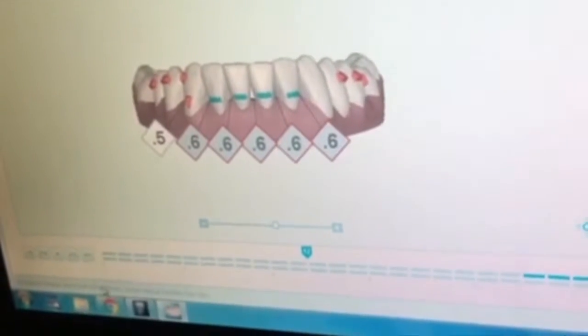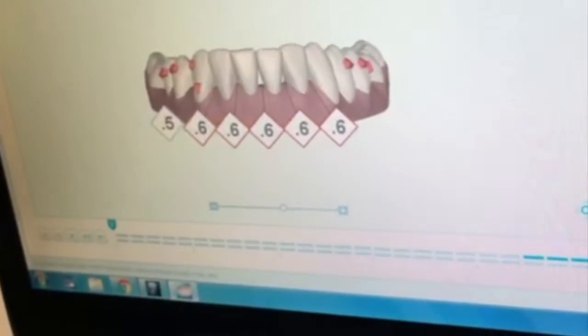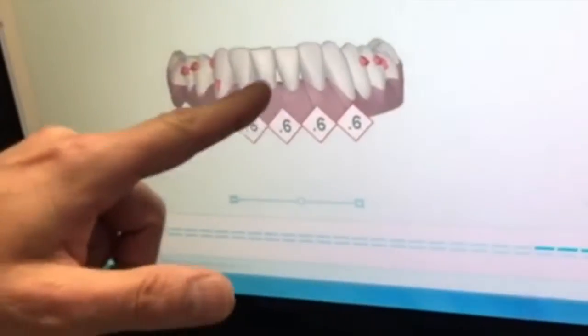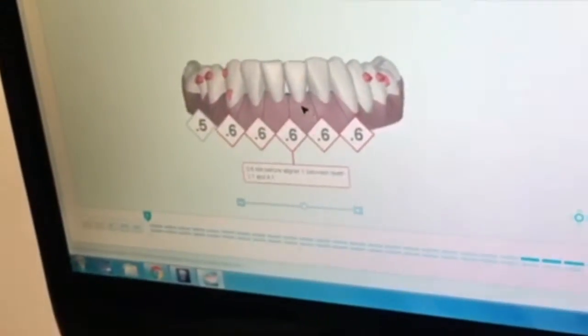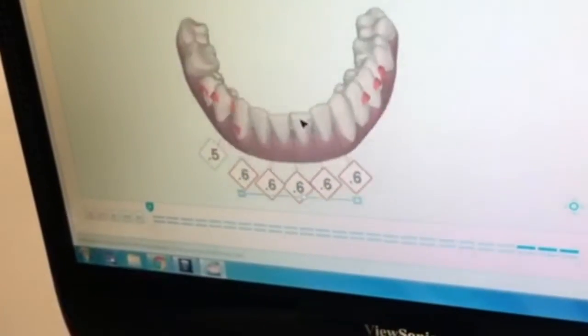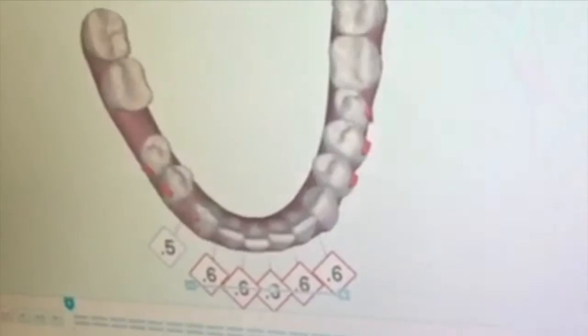I don't know if we can see in the beginning the size of the triangle. It's just quite a bit larger. And it's a way for us to deal with that aesthetic issue at the same time, move the teeth in and create a better arch form.